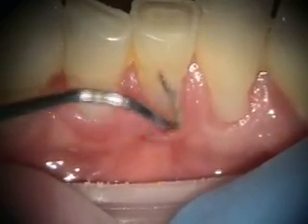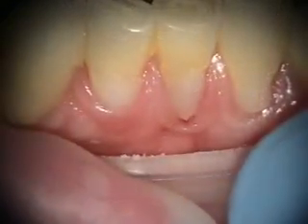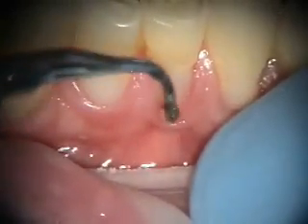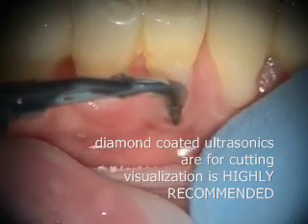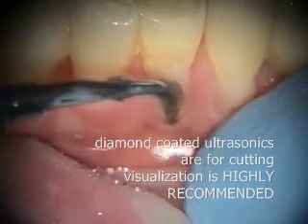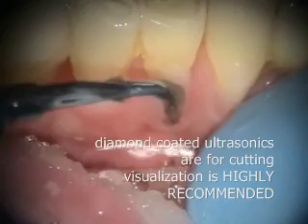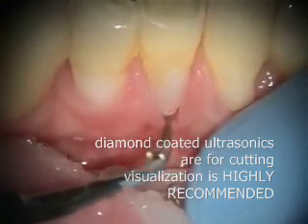What we're going to do is use some diamond-coated ultrasonics and finish these margins. These are our diamond ultrasonics. They are actually custom-made, and we're going to be looking at making more of these for use with the endoscope. It's certainly valuable when you have vision, but you should be able to see what you're doing when you're using diamond ultrasonics.